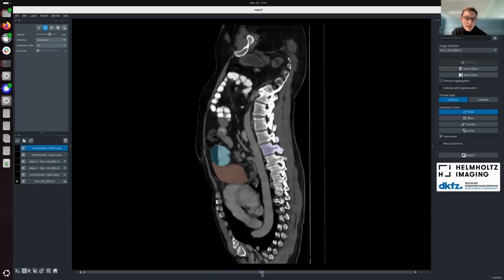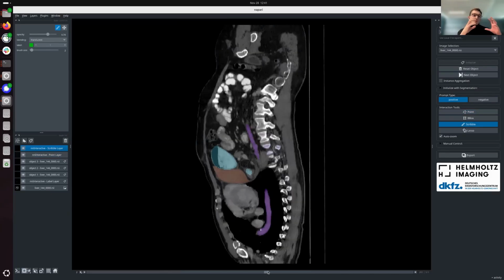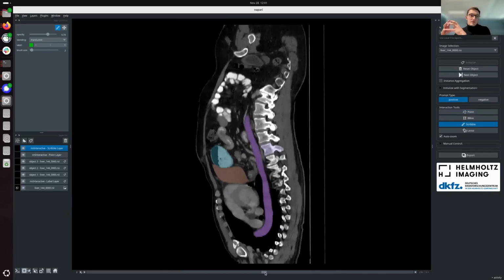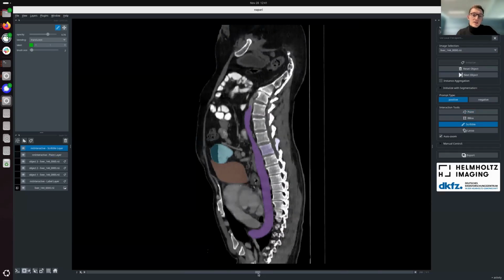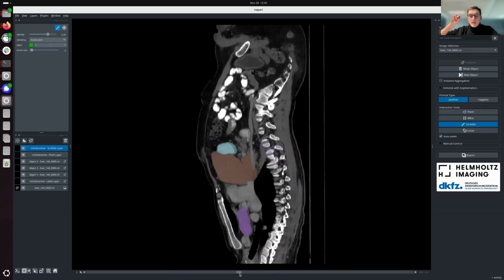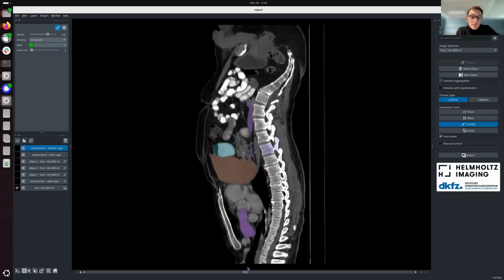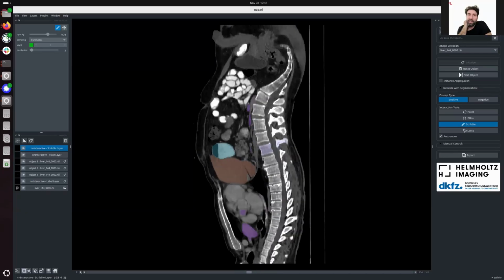But for tracking in 3D, that's also what I'm partially interested in for my PhD. There's also another method out there where we are interested in tumor tracking, but then we have 3D volumes and subsequent 3D volumes. So in this case, it's actually 4D tracking. There we use a registration-based approach: we register the prompt to the next step and then segment again, but we use information from the previous scan. If you're interested, the paper is called Lesion Locator. I can add it to the chat. But as I said, this is 4D tracking.